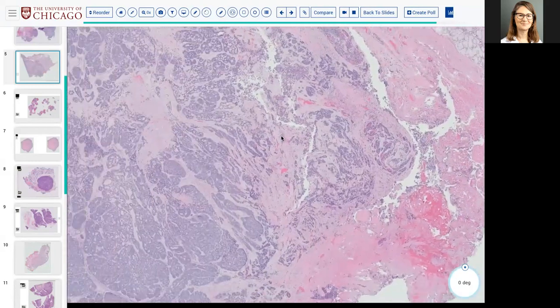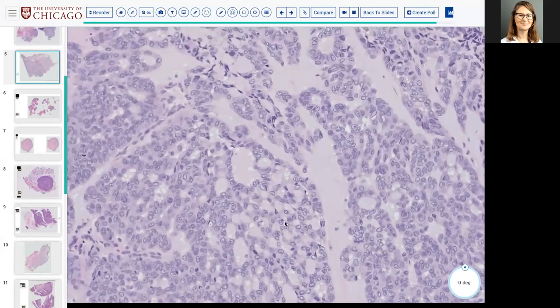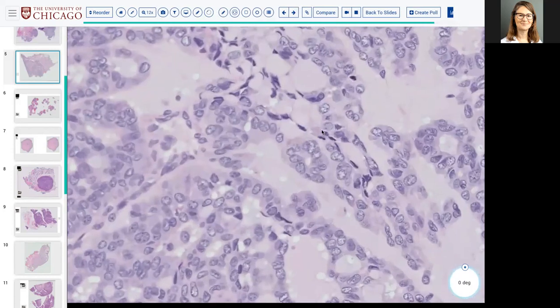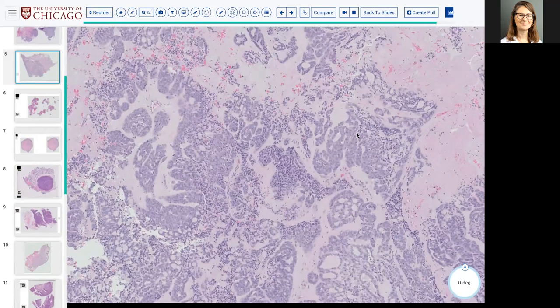The morphology and architecture of adenoid cystic and polymorphous adenocarcinoma can be overlapping, where you can get these cribriform, tubular, or solid areas. But in this case, the nuclei are a little more open with more vesicular chromatin. If you look carefully at some of these smaller, almost duct-like structures, a very good clue on H&E is whether or not you see a peripheral myoepithelial cell layer in these smaller ducts. And I in fact do not see a very clear myoepithelial layer bounding these smaller ducts. So I'm already perhaps biased in thinking that this could be a monophasic neoplasm as opposed to a biphasic neoplasm, in that case polymorphous. But absolutely, doing a P40 is going to be the most helpful thing you can do.